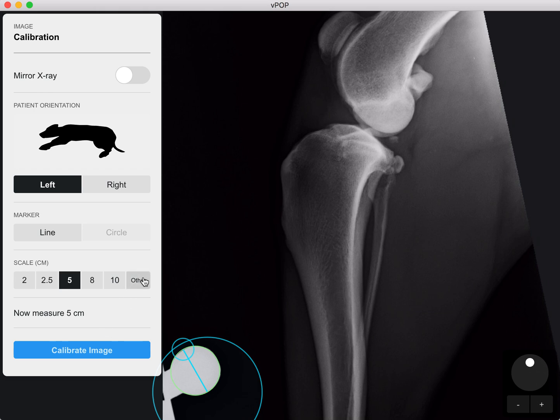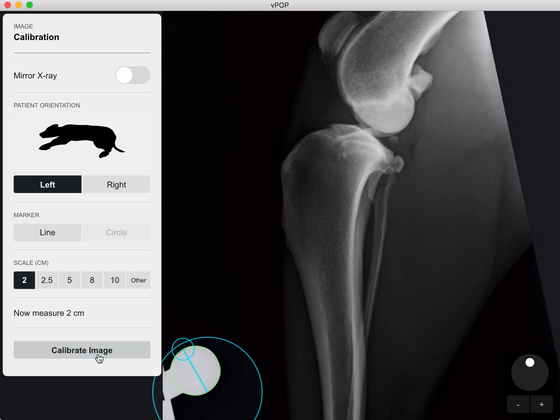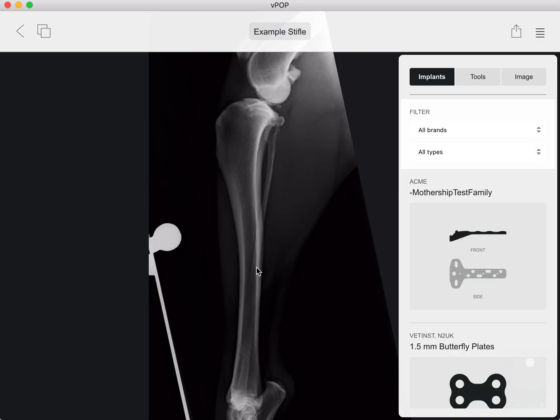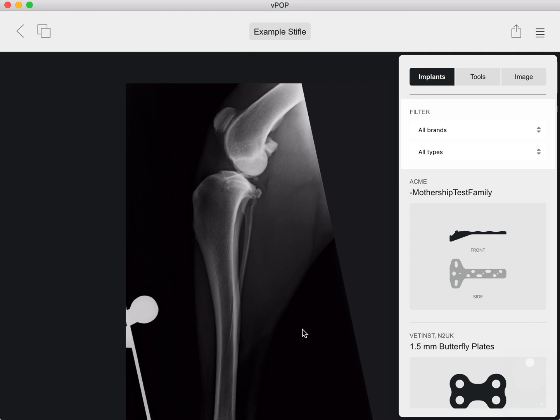Then click any number here that corresponds to your known radiographic marker length or width. In this case it's 20 millimetres, so we'll just click 2 centimetres and calibrate. Now VPOP Pro has a reference so we can start to use the circle tool.